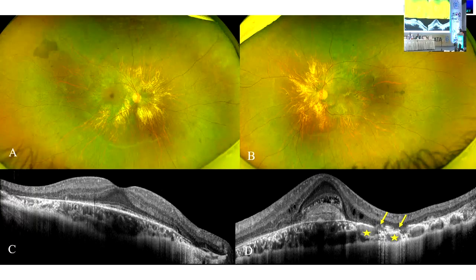No, and there is some pigmentation you can see, yes, sir. So I would really rule out a hereditary degeneration. Yes, we'll call him back and we'll do that before we call this patient choroideremia. Especially the blood vessels also look narrowed. Yeah, the blood vessels are also attenuated. That's one other thing. But here, sir, if you look at the outer retina extrafoveal, there's so much photoreceptor atrophy. That's corresponding to that area of RPE atrophy. As I mentioned, in the center of the fovea, you see one area of RPE spared.